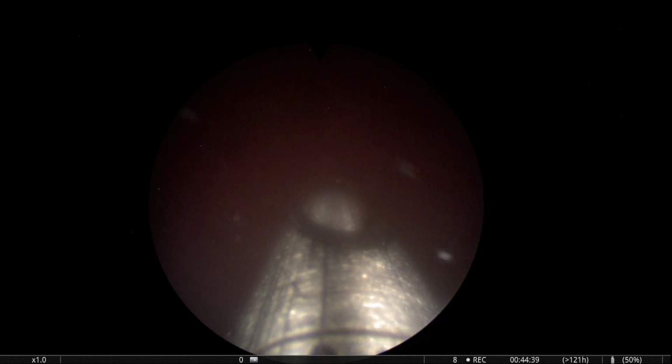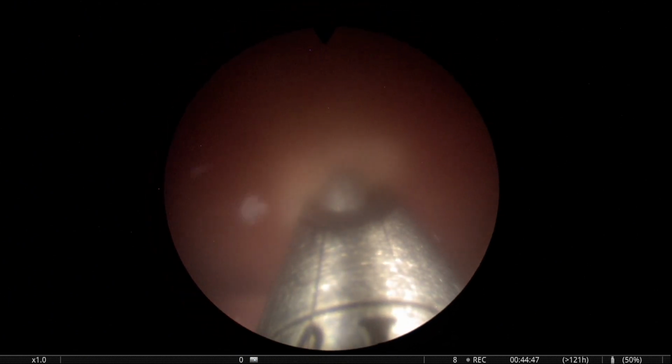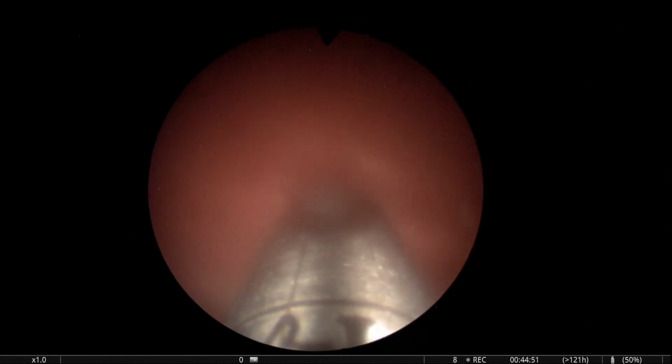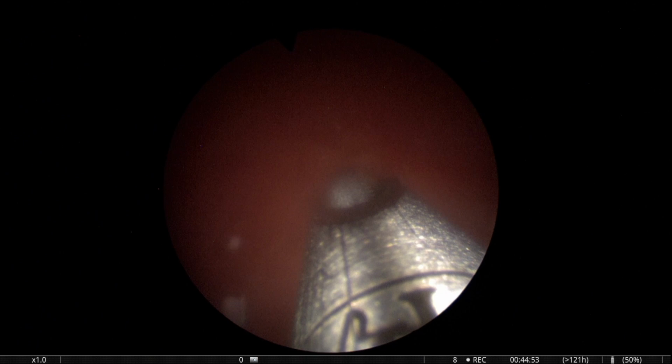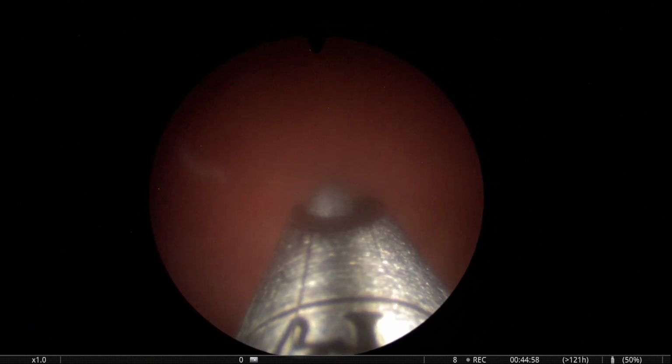Here, we have these small buckets for the water in Bulgaria. So we can do a fast change, but right at the final moment, we had to change because the bucket was full. So this explains the little pause, and then I will try to capture the last little bit of tissue before coming out. There it is.